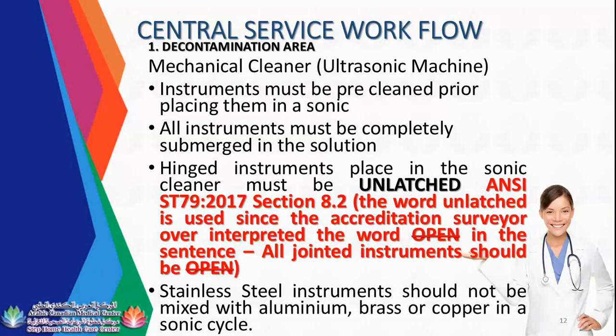As for the new updates of ST79-2017, the word unlatch is used since the accreditation surveyors overinterpreted the word open in the sentence: all jointed instruments should be open. Before, when they said open, for example, just imagine your scissors, they thought it meant to widely open the instruments. But it doesn't mean that it needs to be widely open. It only needs to be unlatched or unlocked if there's a lock. If there's no lock, at least it is open.